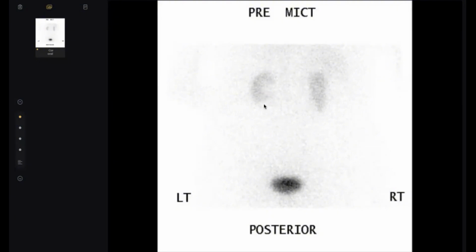Is this the right or the left one? The left one. By the way, it may be rotated. I may agree with you, but don't go beyond the RCR and don't get involved in too many details. Okay, what happened here?